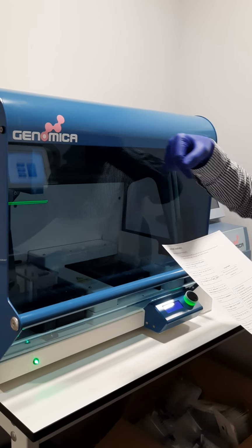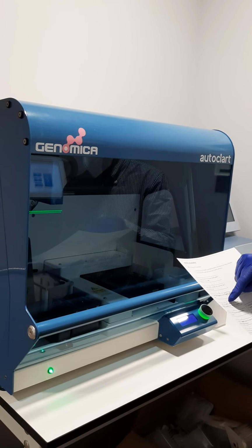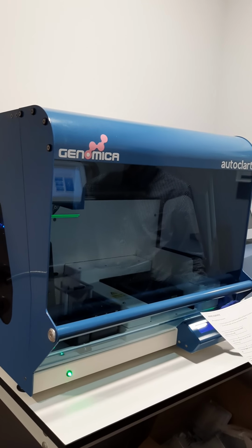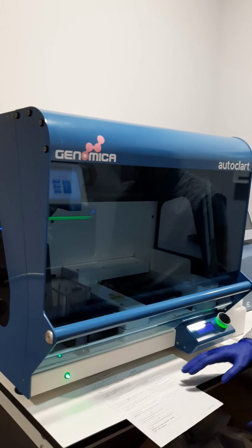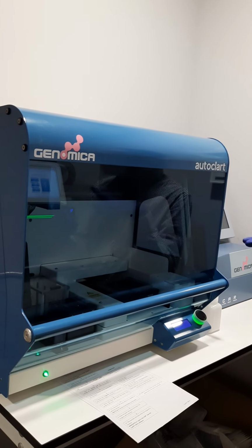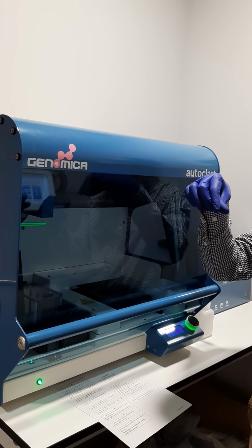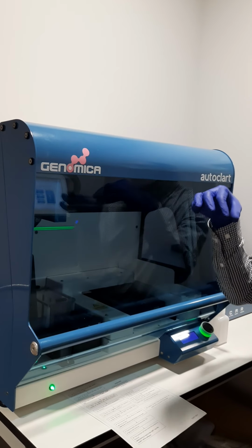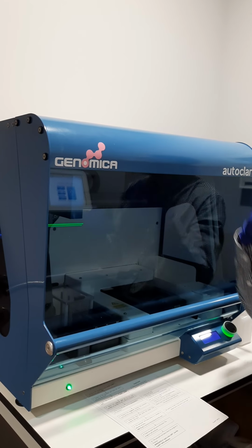So we can start in the A1, the first position, or in the fifth one, E1. A1 or E1. What's the difference? If you have the visualization kit, I think it's in the fridge. But when we open the envelope with the strips, we are going to see that one strip has 8 wells. Ah, like the plates. So imagine that, for example, we analyze 4 samples. We are going to have 4 wells left that we have not used, and we can use later.